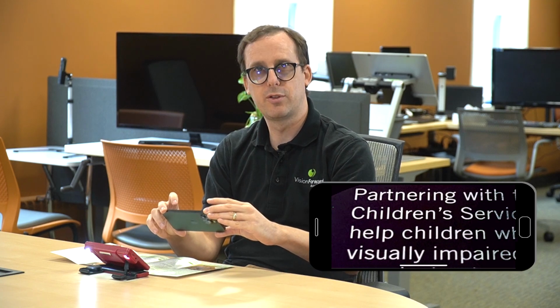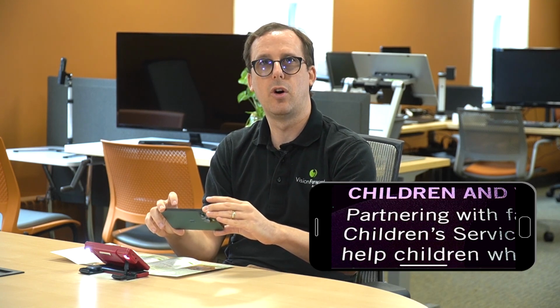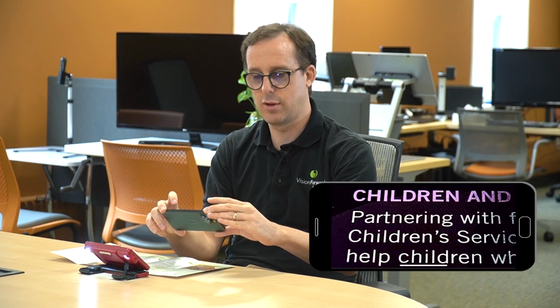One of the difficulties of reading using your phone is always going to be the problem of trying to hold the phone steady as you are reading. Now, this might not be such a big issue for smaller amounts of reading, but if you want to do any significant amounts of reading, it really does become a bit of a pain. Although ReBokeh does have some image stabilization built in, it still is going to be very much dependent on how well you can hold your hands and arms steady as you're trying to read.